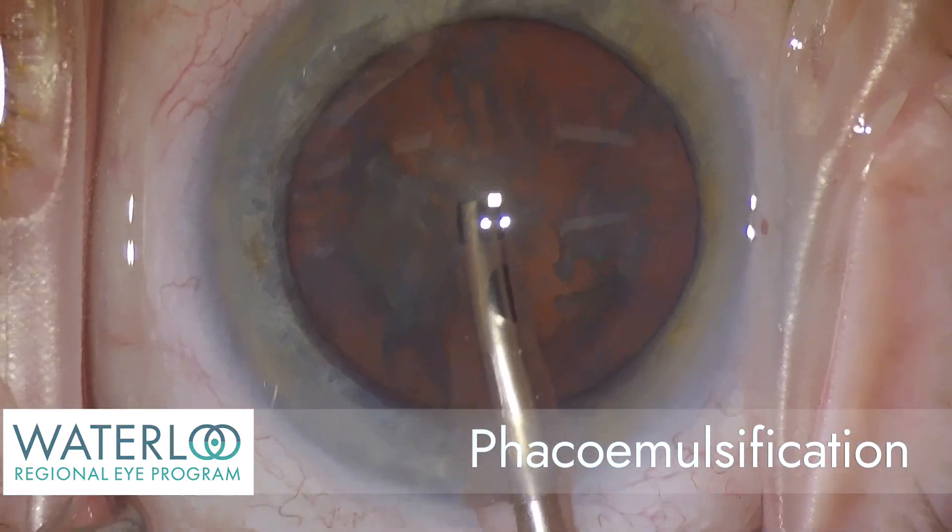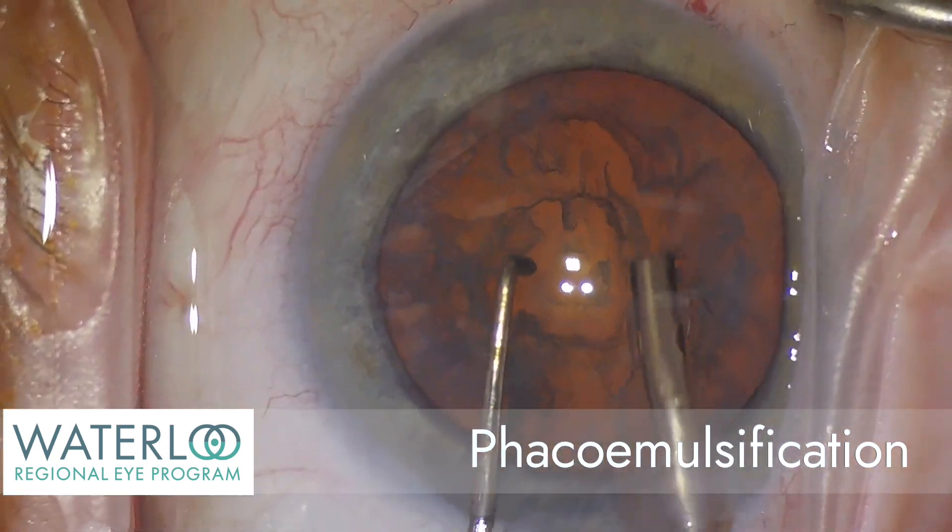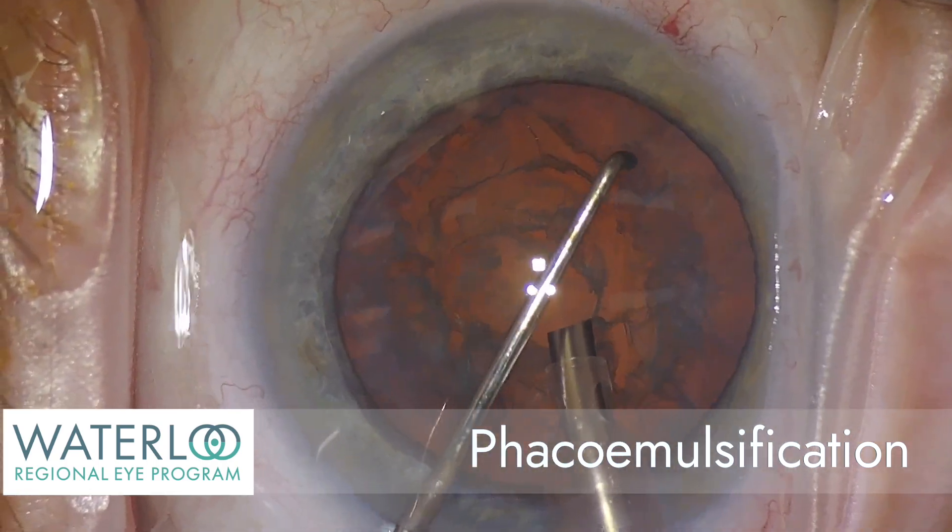Phacoemulsification is a sophisticated ultrasound technology that allows the surgeon to break the cataract up into segments for removal.